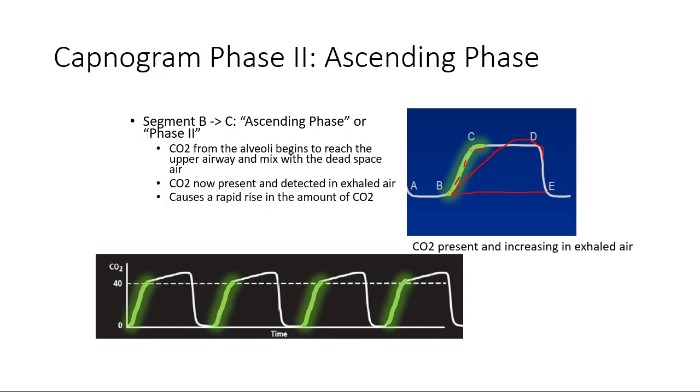So what we see here of phase 2 is the sudden uptick of CO2 as we begin our respiratory exhalation, and then it will plateau off. This image down here that I'm pointing at makes it look like there's still a sharp increase. There won't always be. Sometimes they'll plateau out fairly nicely.